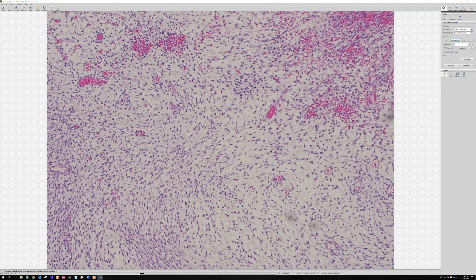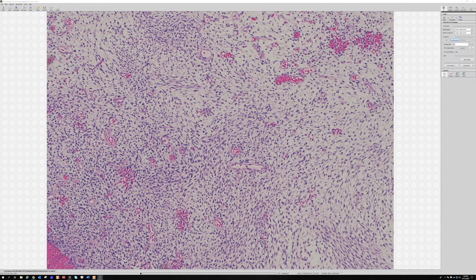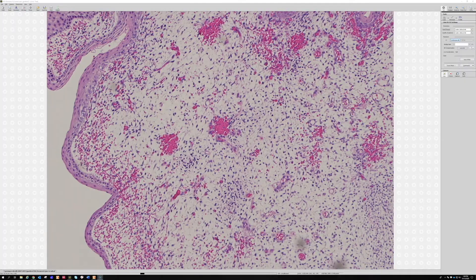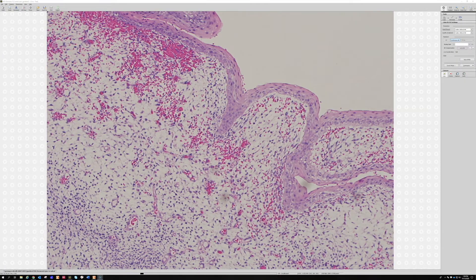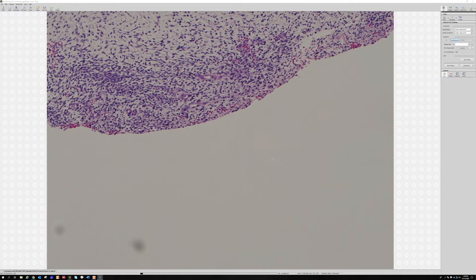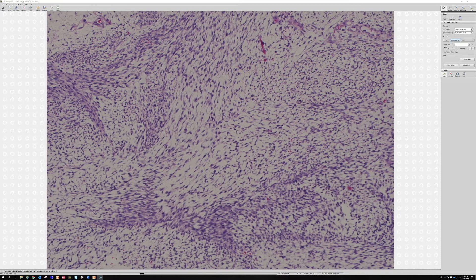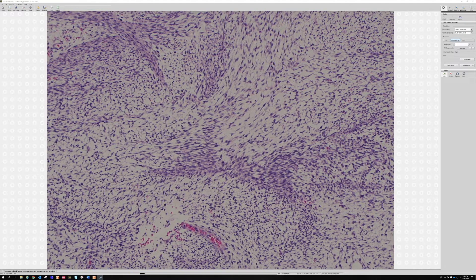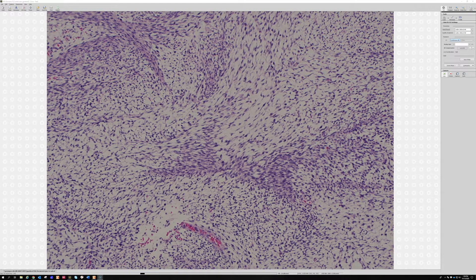I was debating whether there was or was not a grenz zone in this. A grenz zone — like a layer where it's not involved? I only really think about grenz zones in the setting of dermpath, not so much mucosal sites. And even though a lot of people talk about grenz zone and teach it, I personally find that for most of the time it's not that helpful a concept, even though it's very popular and everyone loves talking about it.